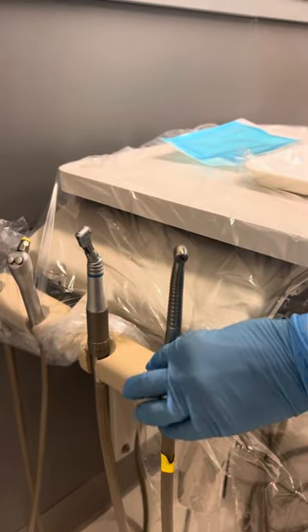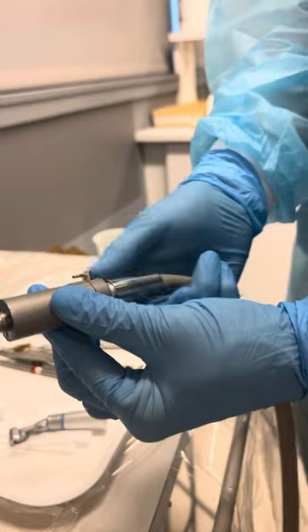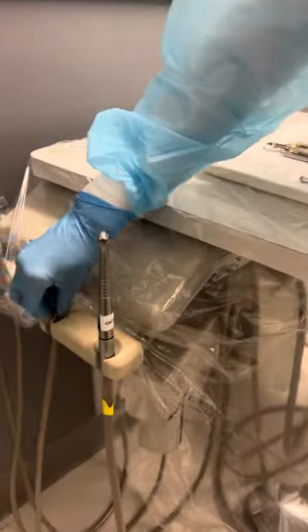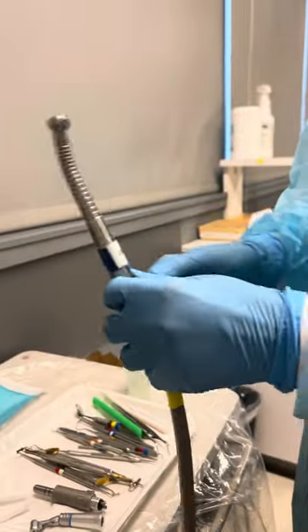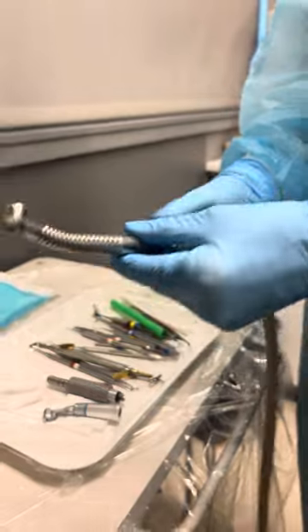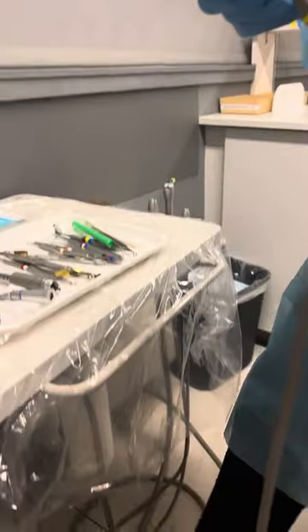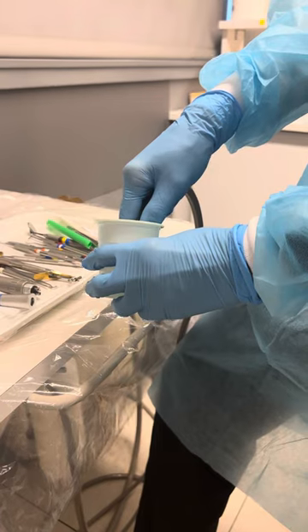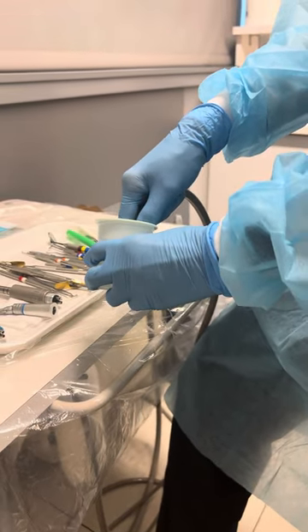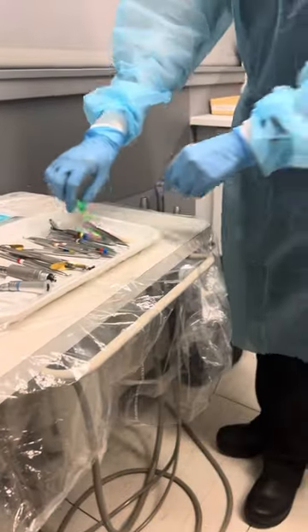Now we have handpieces. The slow speed does not have water in it so we do not need to run that one — she just pulls it off and untwists where she put it on. The high speed has water coming out of it, so she's going to take off the handpiece and unscrew the collar. Then she'll run the handpiece in a cup using the rheostat down here for 20 seconds. The handpiece goes right back in and she can get rid of that cup.